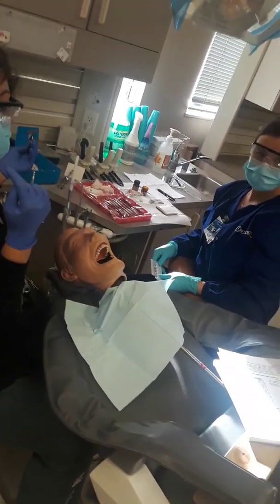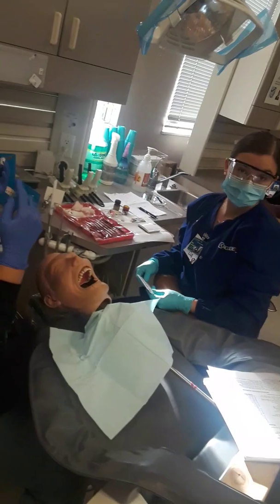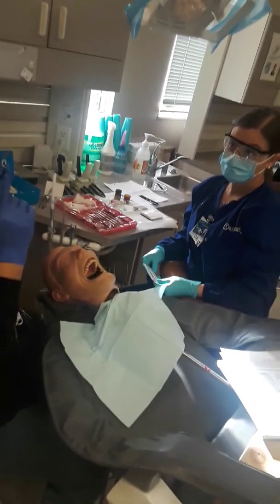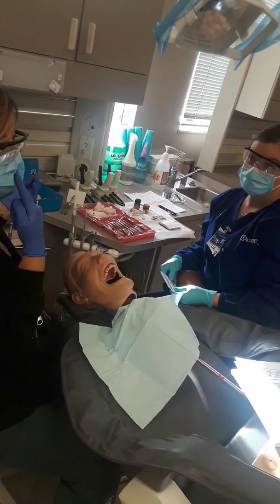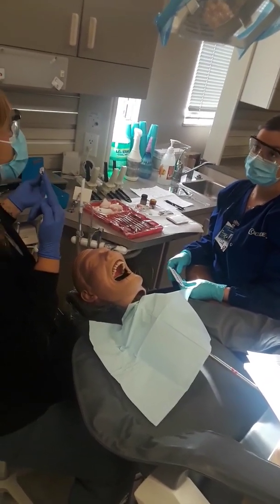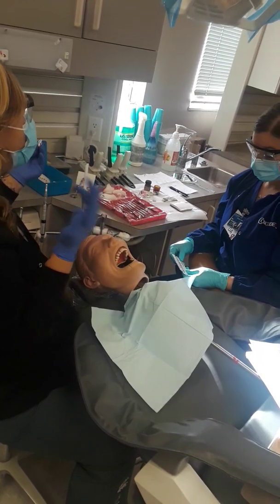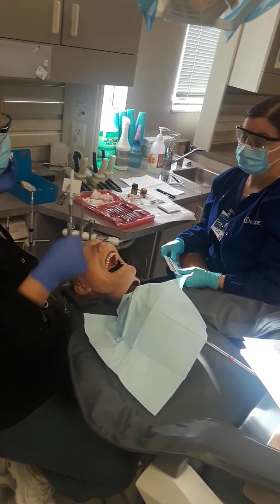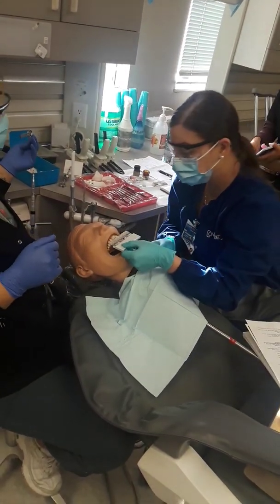So what we're doing is matching the tooth to the crown that we're going to make, and we want to make sure it matches perfectly, because obviously it's going to be a front tooth, and you don't want it to be a different color, like maybe yellow or gray, and stand out like a sore thumb. So I always want to turn off that light. I'm just going to say check.